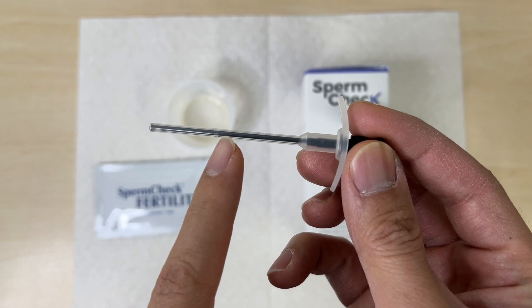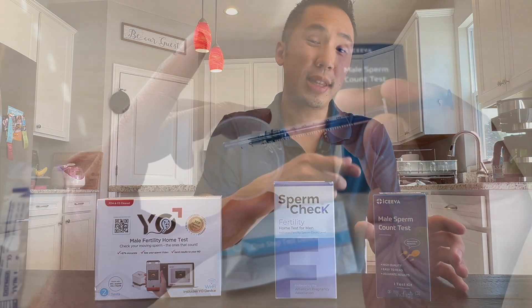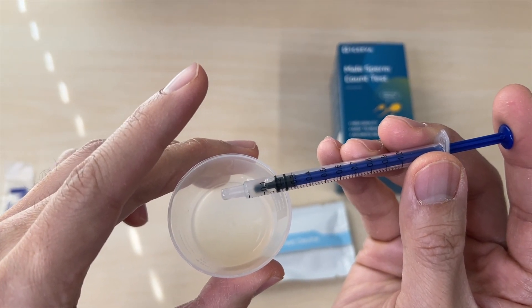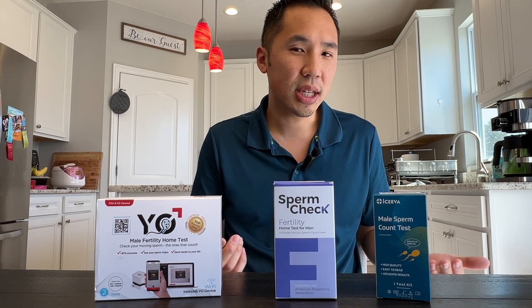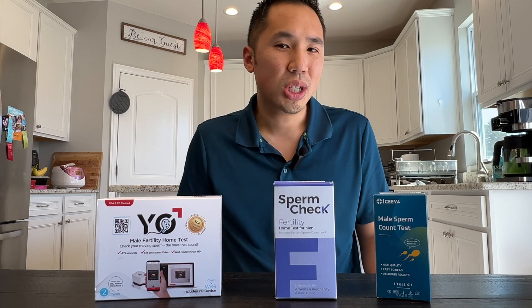The syringe for the SpermCheck test was also very intuitive. There's only one line, so you know exactly how much of your sample you need to add to the solution. Versus the ISEVA, that syringe had so many lines and numbers — I could see someone potentially not getting the right amount of sample into their solution mix.